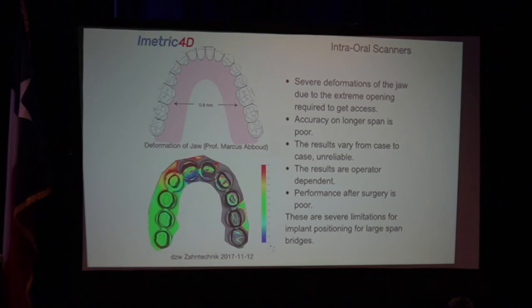So I'll tell you guys now that we just don't show it. Like I'll tell you, all my hybrids used to fit when I was intraoral scanning, but nobody sees that. So we're stitching, right? We talked about stitching. So the Trios makes this noise when I'm scanning. It goes tick, tick, tick. So the first pass is the most important.